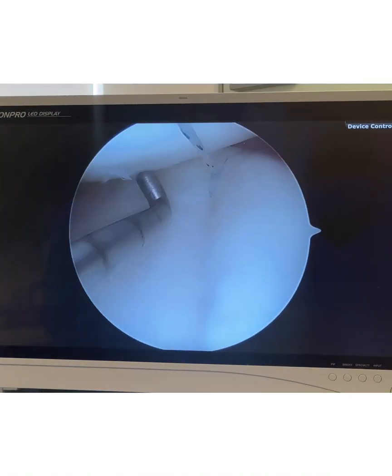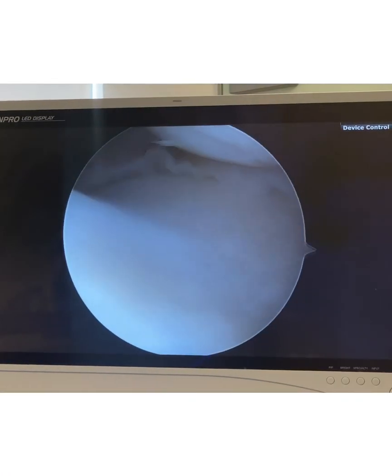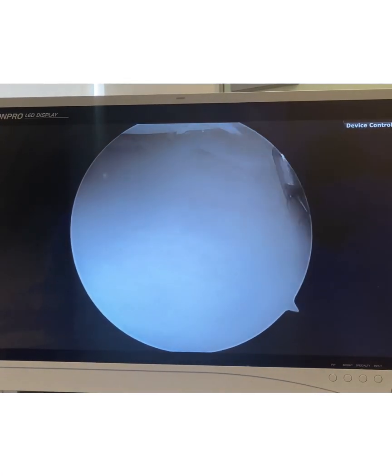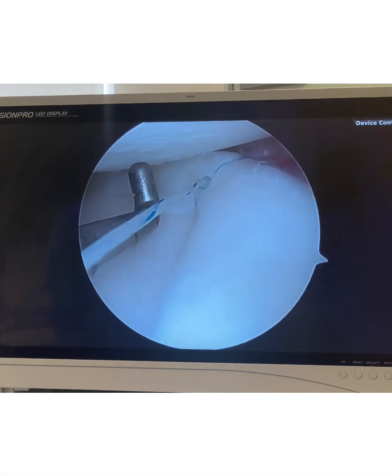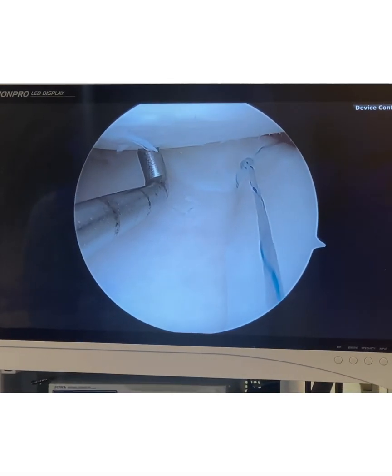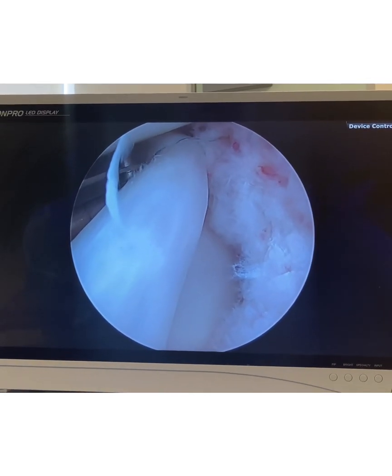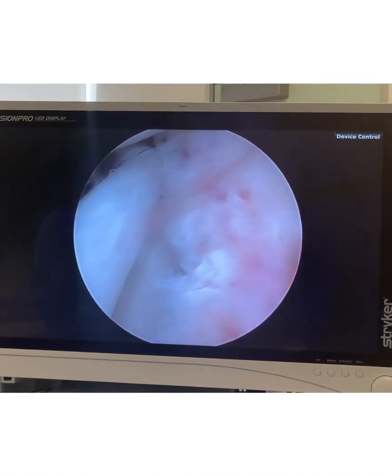So far I've got it locked in towards the front. I already have one suture back there reducing the bucket handle medial meniscus. That's just two of the many sutures we're going to be putting in here to reattach this back to the capsule.